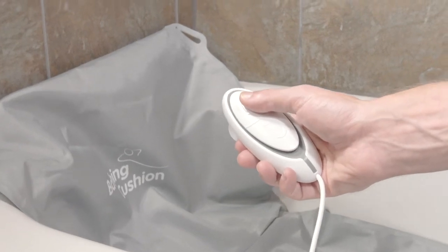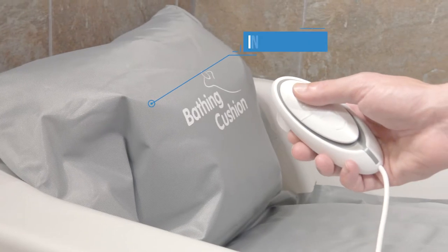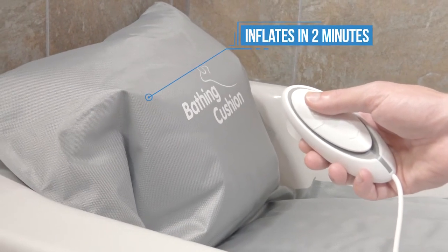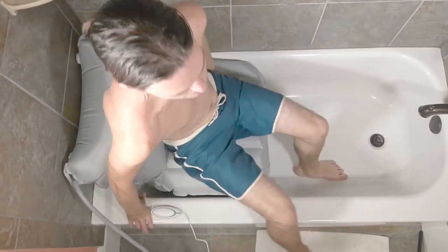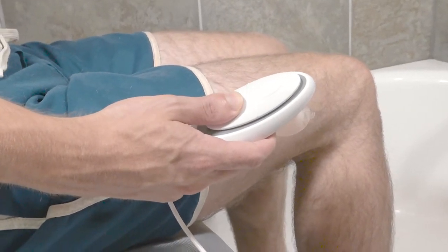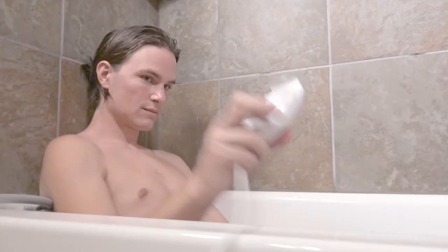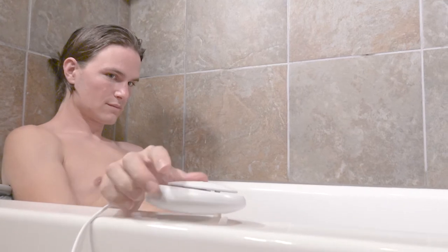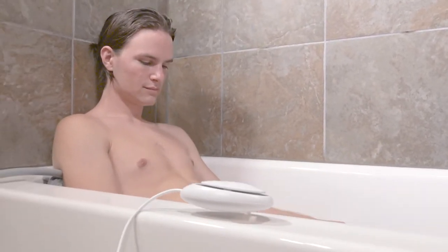Press and hold the up button on the controller to inflate the bathing cushion fully before you fill the tub with water. Sit all the way to the back of the cushion, then press and hold the down button on the controller to lower yourself into the tub. With the bathing cushion deflated, you should be all the way at the bottom of the tub while the backrest provides additional support.